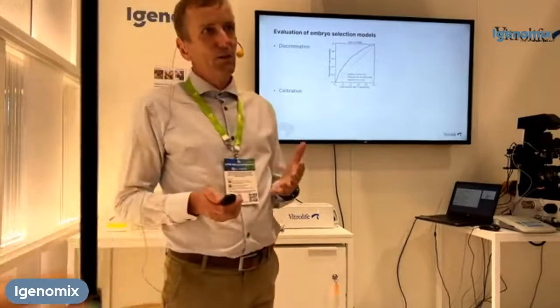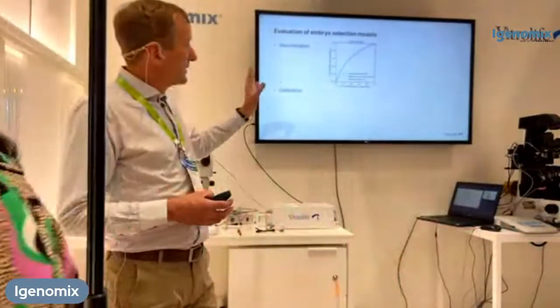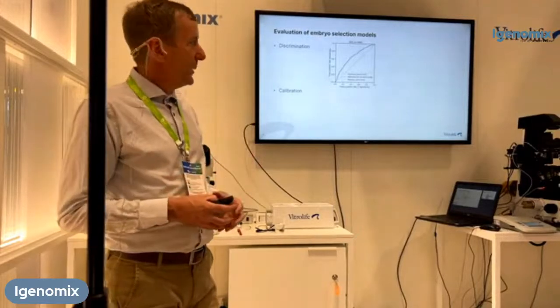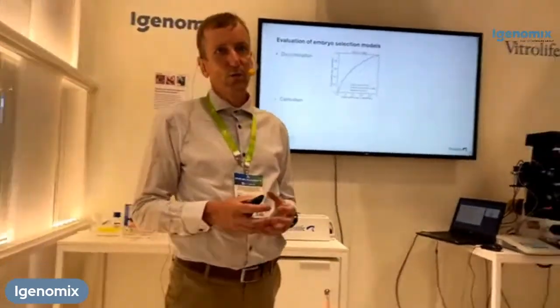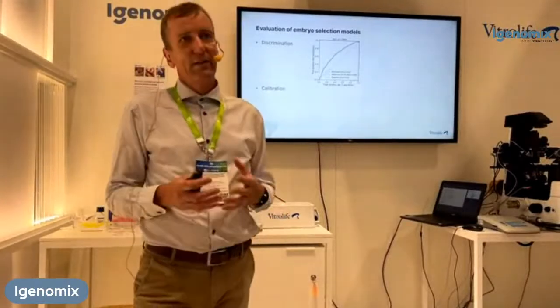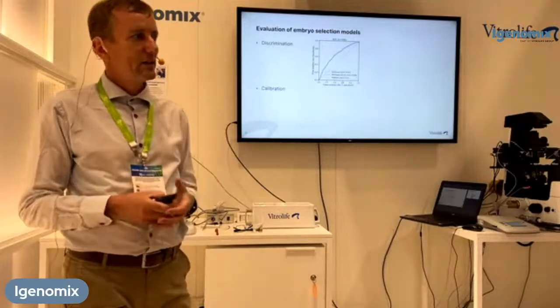That is usually evaluated by using what we call a ROC curve, like the one shown on the graph. Here you evaluate the area under the curve, so that you get what we call the AUC value. That number indicates how good the ranking is.